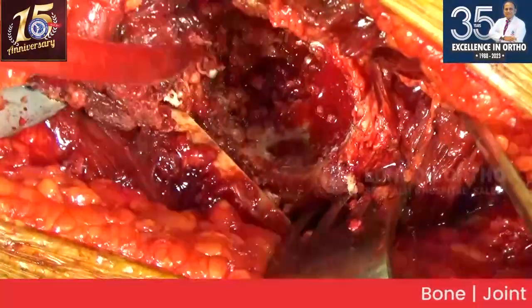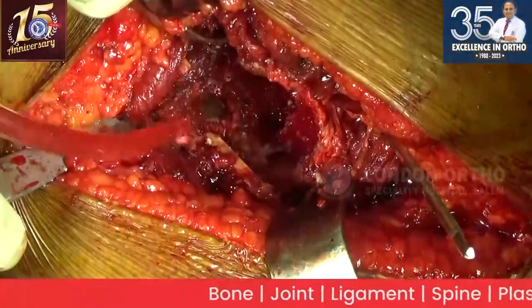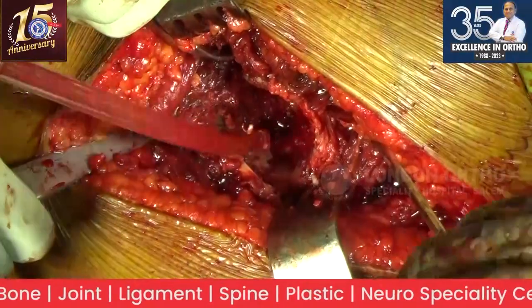But it's nice curettings I'm getting. So I am approaching the medial floor, but I don't want to push it. Okay. Bone graft at which, bro?